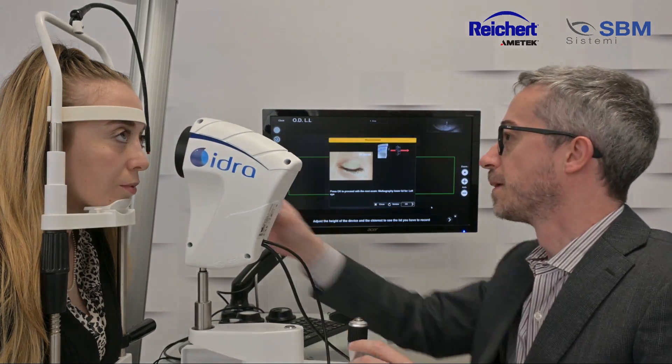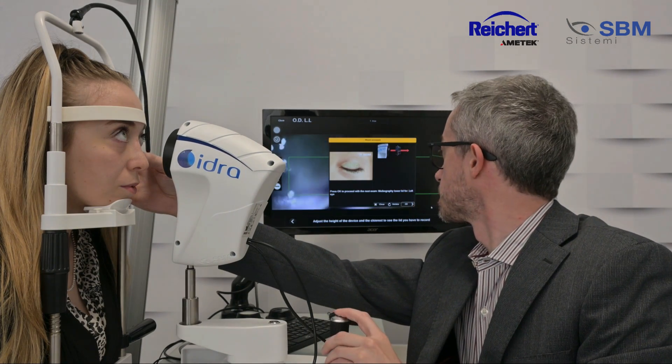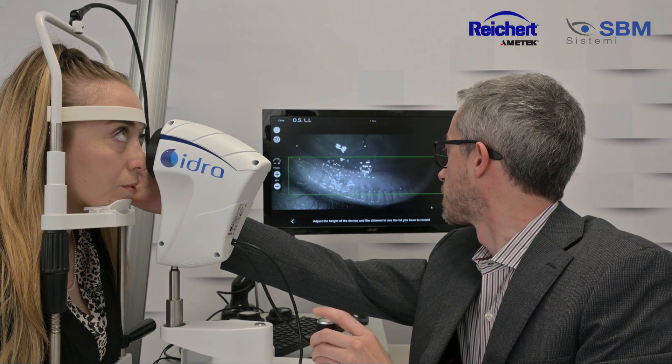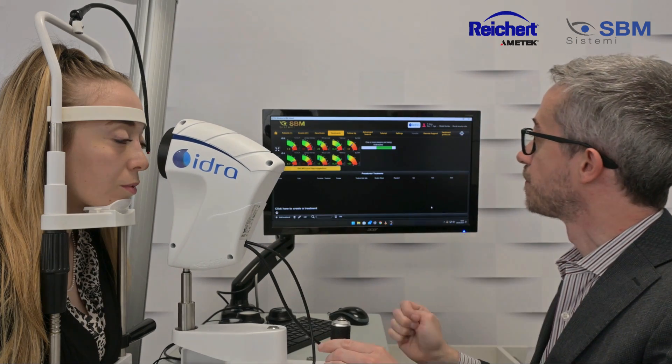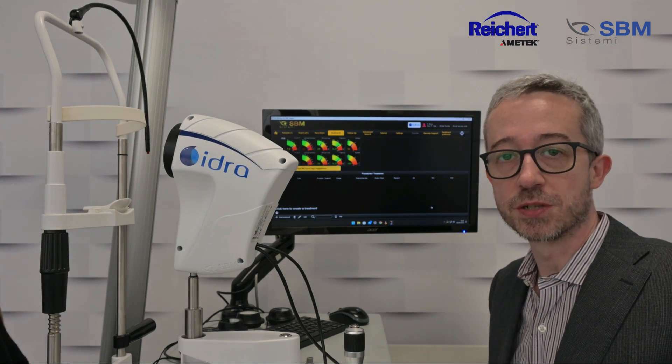One eye. And the other. And the Fast Wizard acquisition is done.